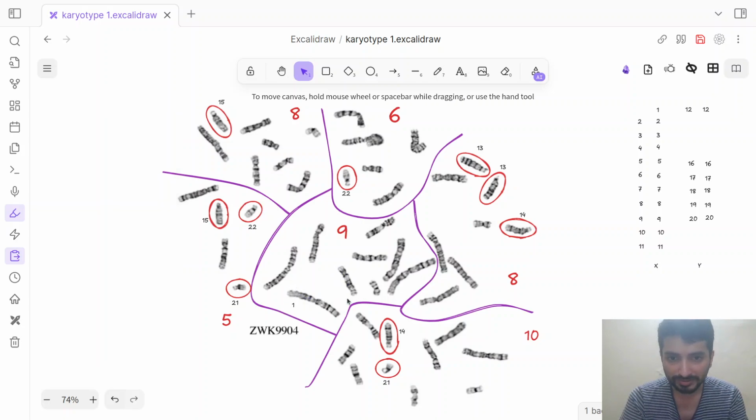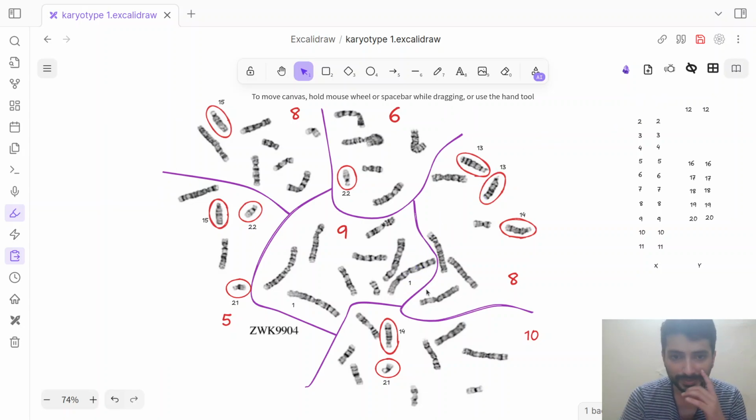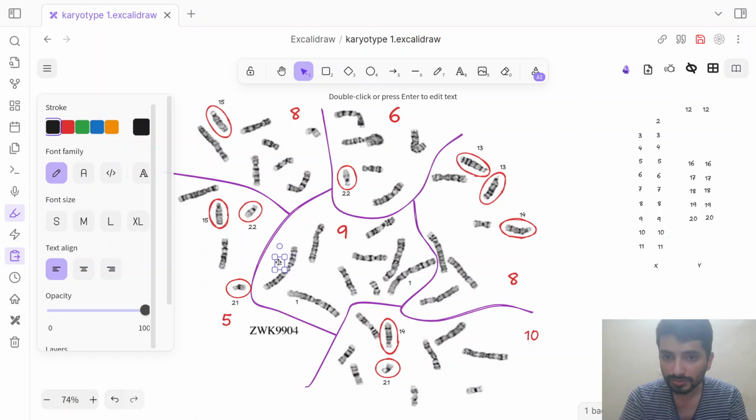And we can find chromosome 1, another one, right here in the same sector of this metaphase spread. So that is great. We have already identified chromosome 1. Now chromosome 2 does not have very prominent band at the center, that is at the centromere, but the rest of the chromosome is very well banded. So you are looking for a chromosome that is similarly sized to chromosome 1, but has multiple bands and no particularly dark staining at the centromere. So this looks like chromosome 2.